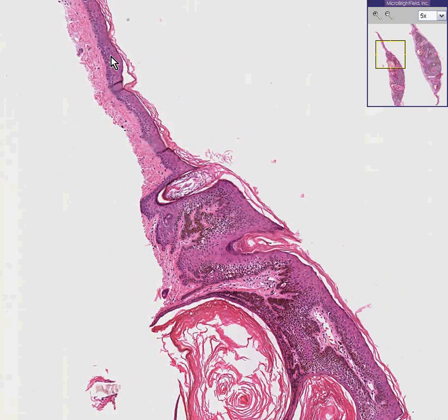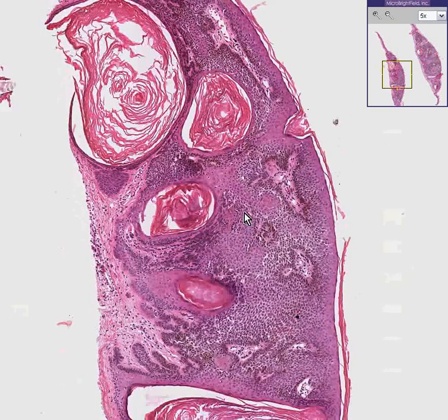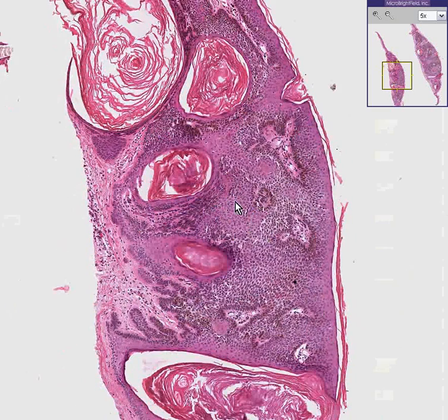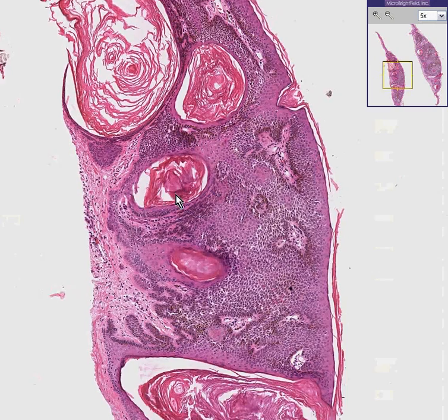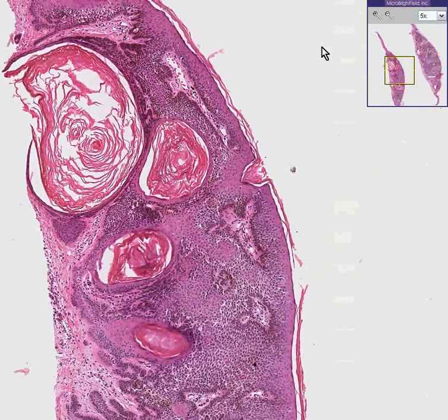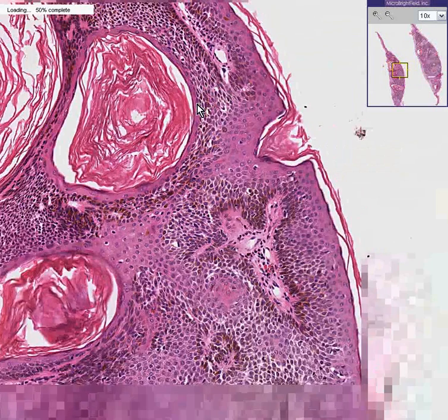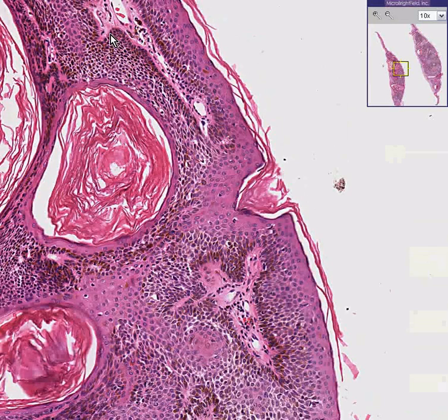Here is the normal epidermis. You may see a couple of melanocytes here at the base. Here's a nice thin stratum corneum. Here's an area where there is proliferation of the stratum spinosum or prickle cell layer — increased numbers of invaginated keratinized material having a circular or whirled configuration. And sometimes, you can see a nice rim of melanocytes along the basal layer as well.